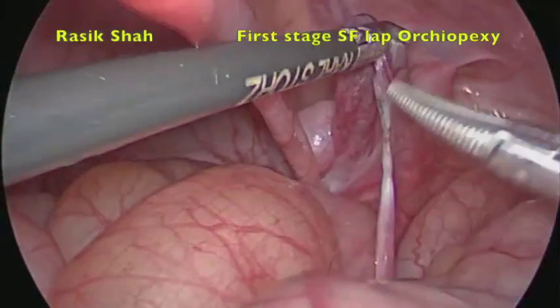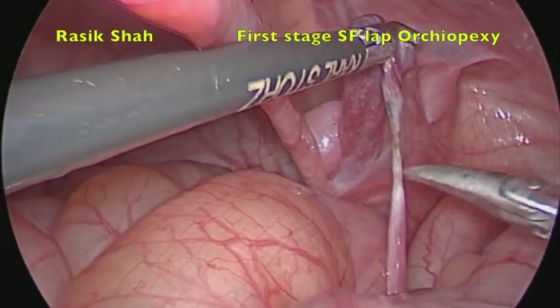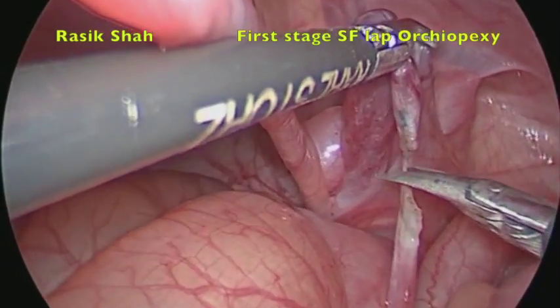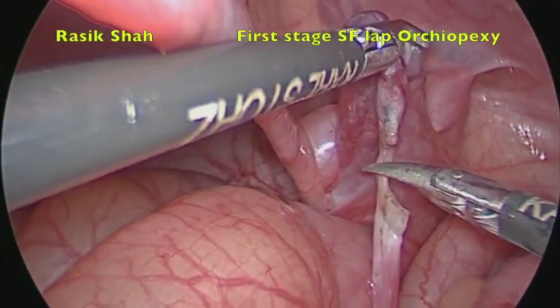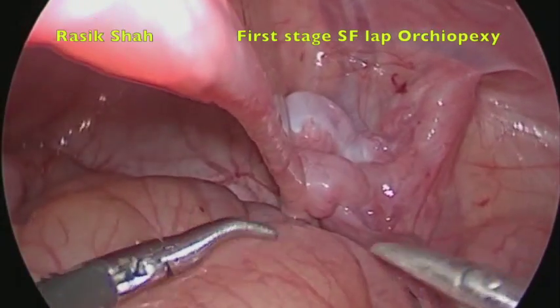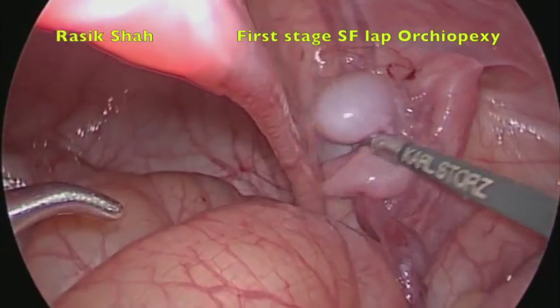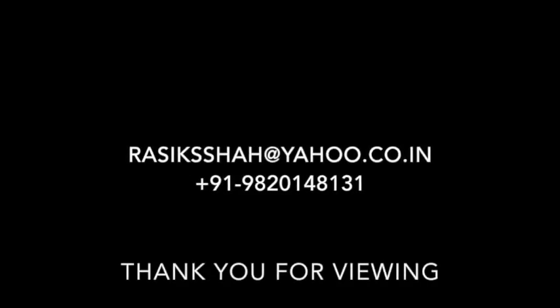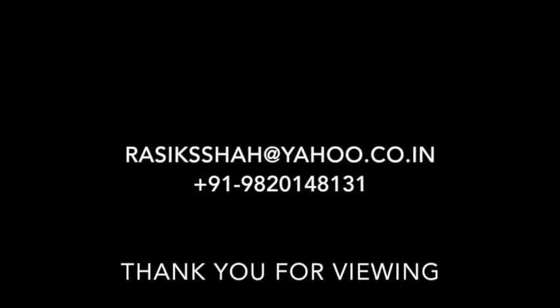The testicular vessels are now controlled and being divided using 3 mm scissors. Usually after this, we wait 6 months for the blood supply to return back to normal. In experimental studies, it takes about 1 month for the testes to regain blood supply to normal.